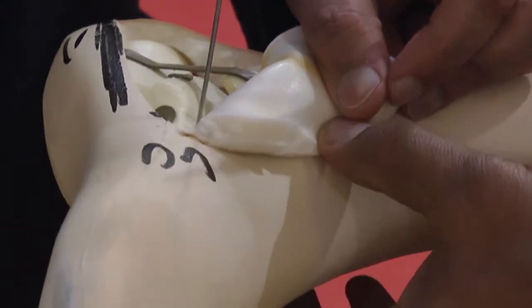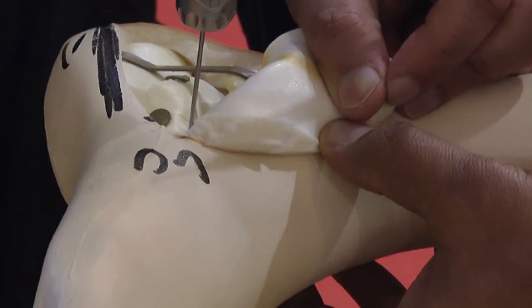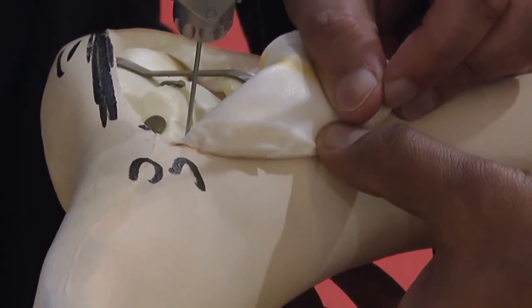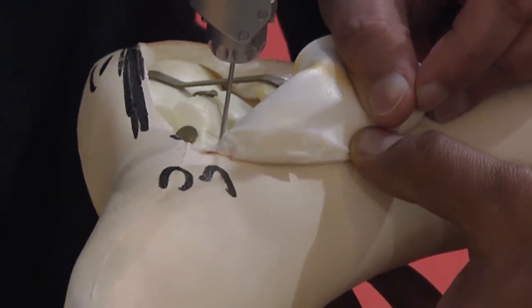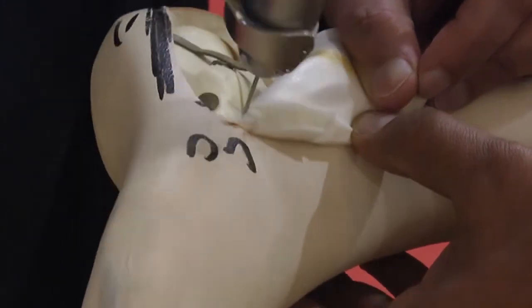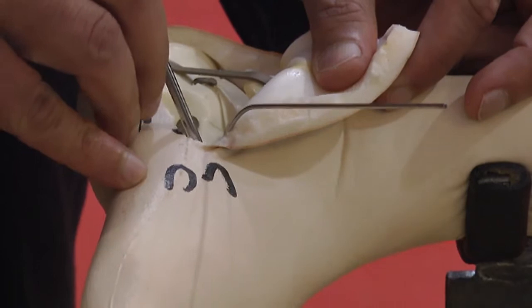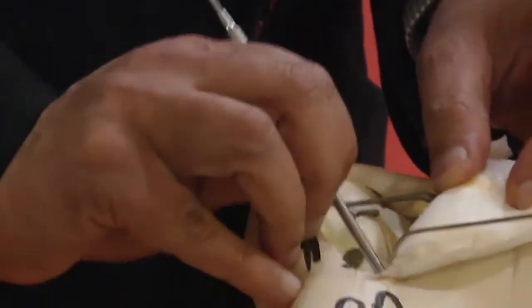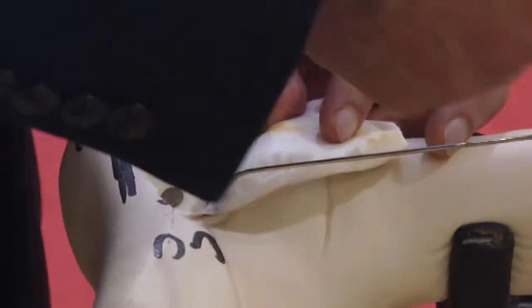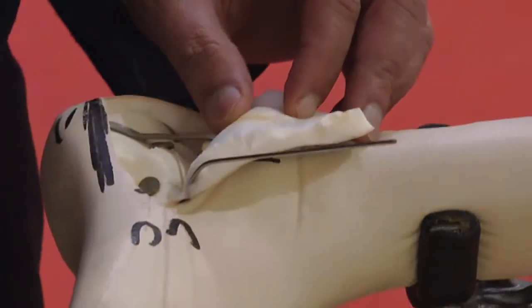That is an angle where the peroneal tendons are prone to injury, because they curve; the peroneus longus curves around the cuboid. So once you are dissecting this part of the flap, you have to be doubly sure that the tendon has been retracted, and your wire goes under the tendon and then lifts off the tendon, so that the wire is retracting the flap, the tendons with the flap.